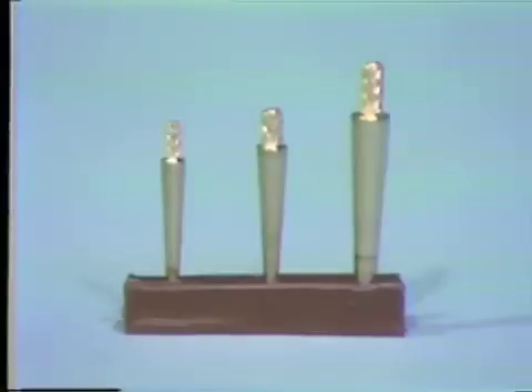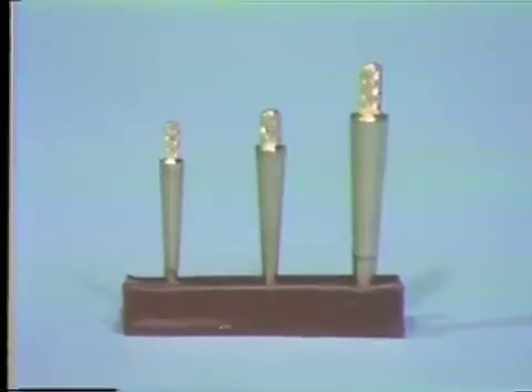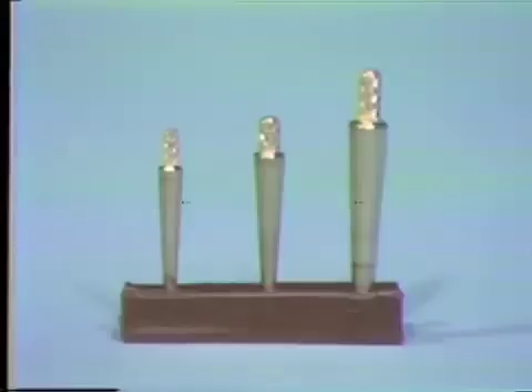There are three main sizes of dowel pin: large, medium, and small. The large dowel pins are generally used in molars, and the small in teeth such as lower lateral incisors. For this exercise, we use the medium-sized dowel pin.